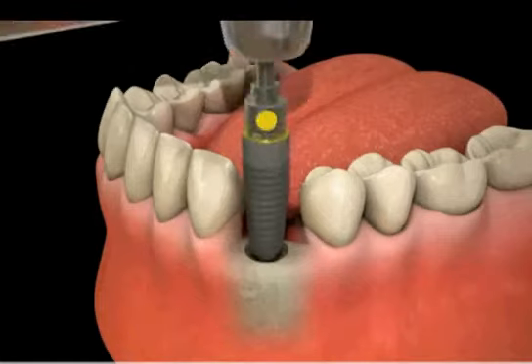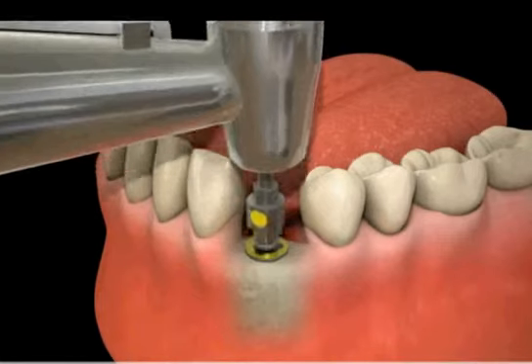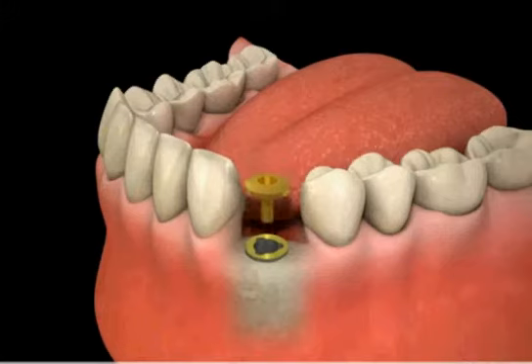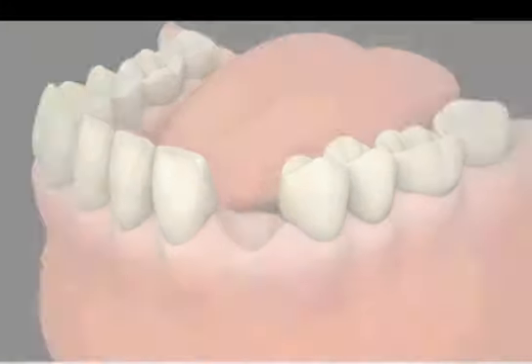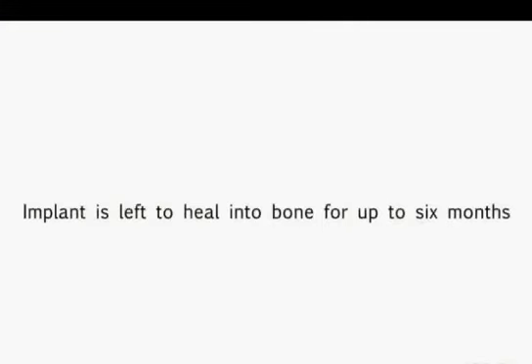After proper preparation, the implant is placed into the bone and it is then sealed with a small cover screw. The implant is then left to heal in the bone for up to six months.